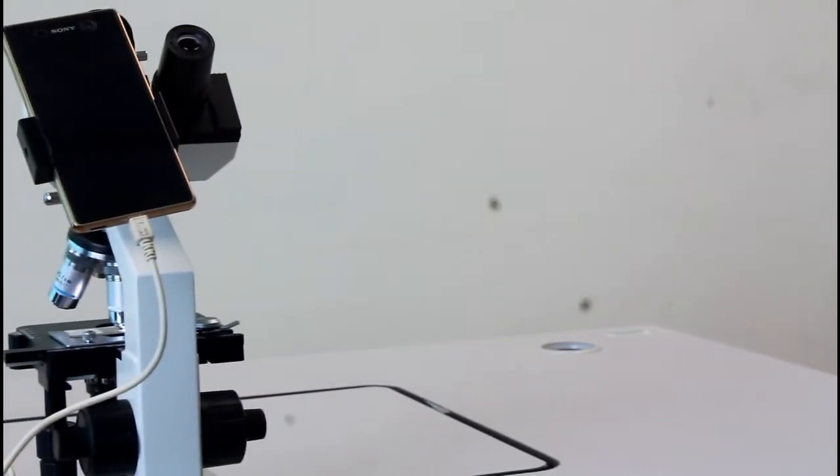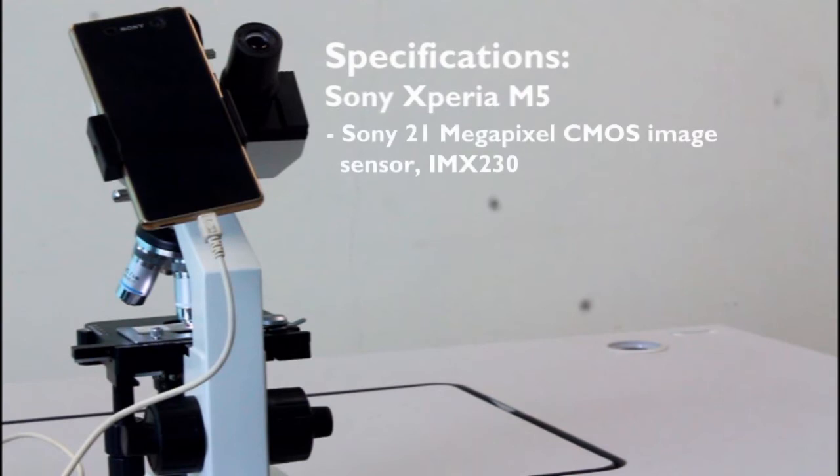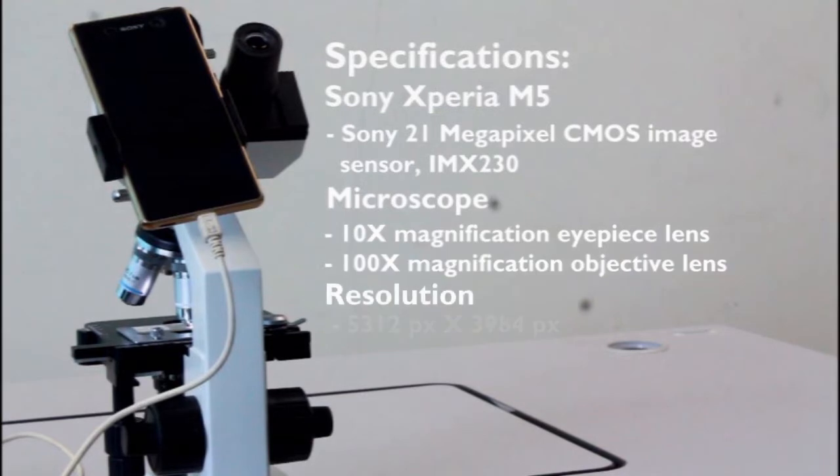For the specifications of this project, the mobile device used is the Sony Xperia M5, which uses a Sony 21 megapixel CMOS image sensor, IMX230, to capture the image from the microscope. For the microscope, an eyepiece lens with 10 times magnification factor and an objective lens with 100 times magnification factor are used in the light microscope. Therefore, an image with a resolution of 5312 pixels x 3984 pixels, nearly 21 megapixels, is captured.